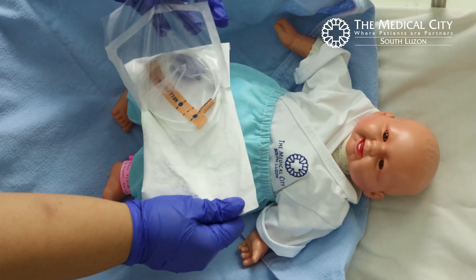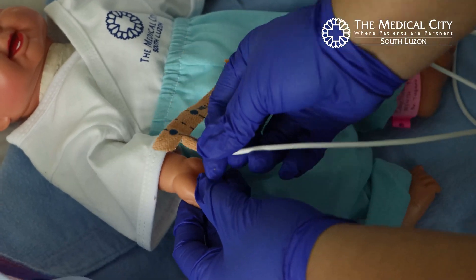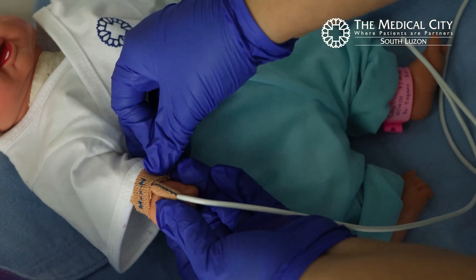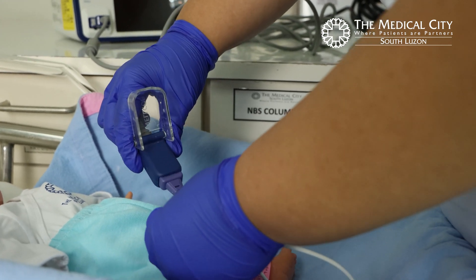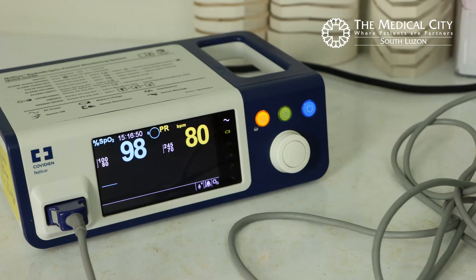Remove the probe from the package. Wrap the probe around the patient's right hand or wrist. Connect the probe to the oximeter and turn on the pulse oximeter.